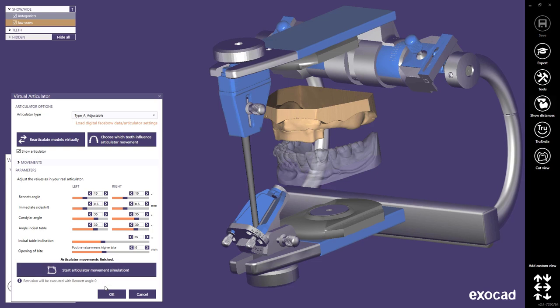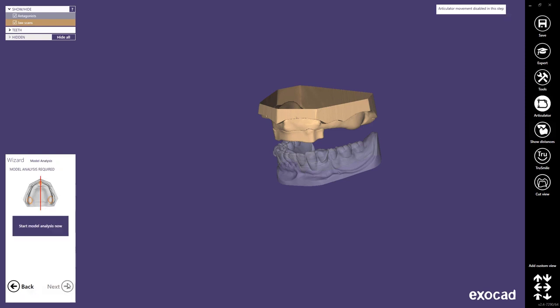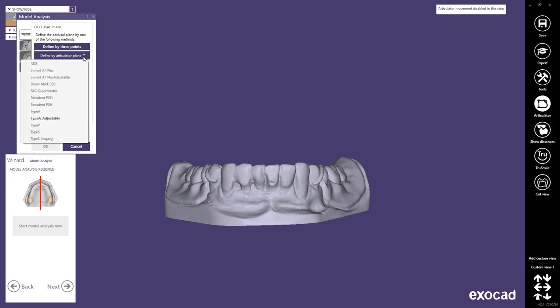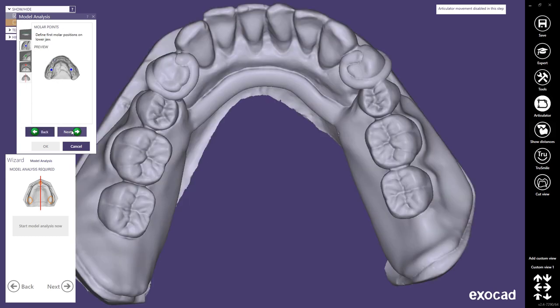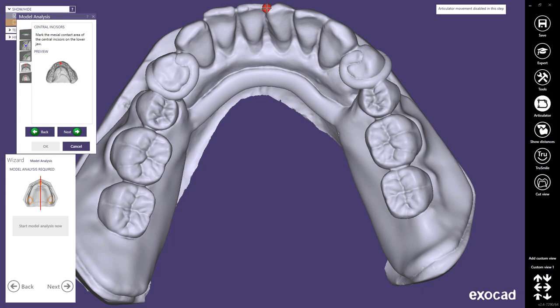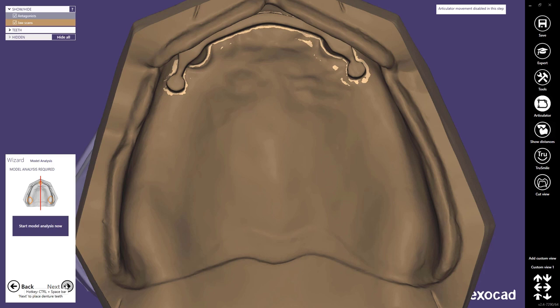Once the virtual articulator is finished you can press ok and you will be back in the wizard mode. If you press next you will reach the next step which is the model analysis. You will realize that for the single arch dentures there are only four single steps for your model analysis. For the occlusal plane in this case we can select the occlusal plane of your virtual articulator. Then you have to select some points for your molars, premolars, and your incisor point. The midline of your model will be generated automatically based on those points, and you're done with your analysis.